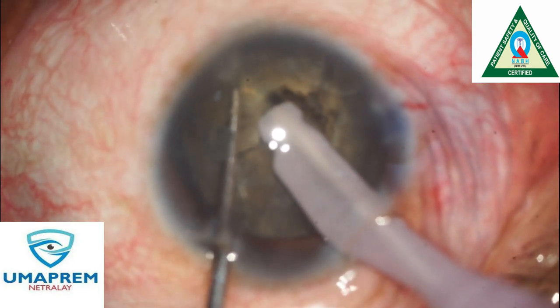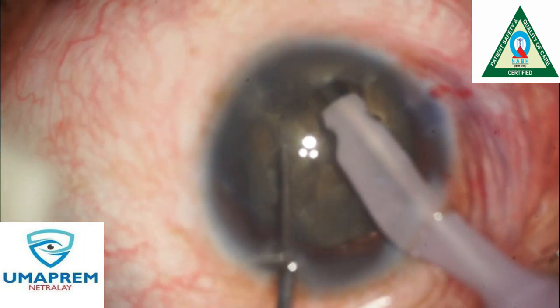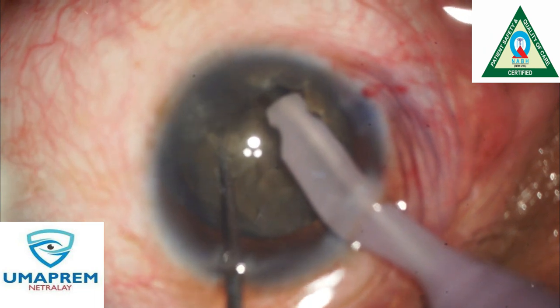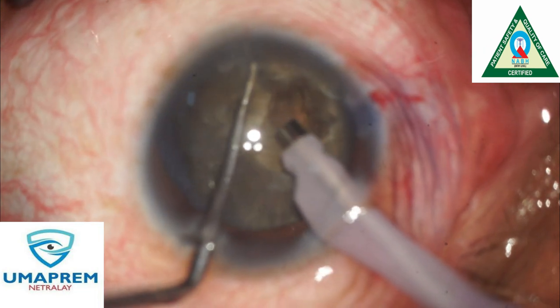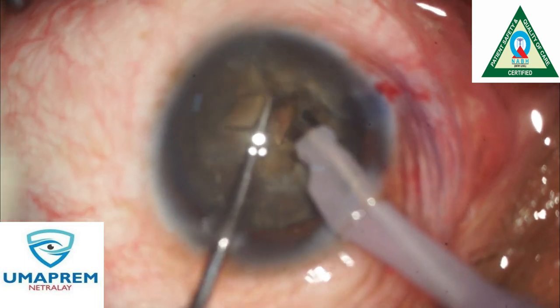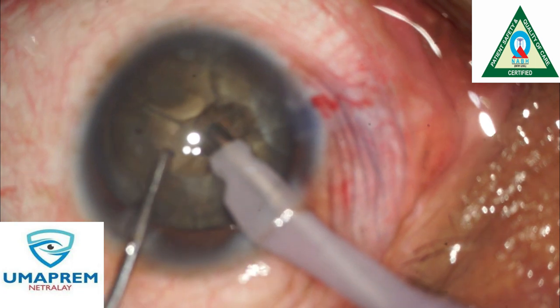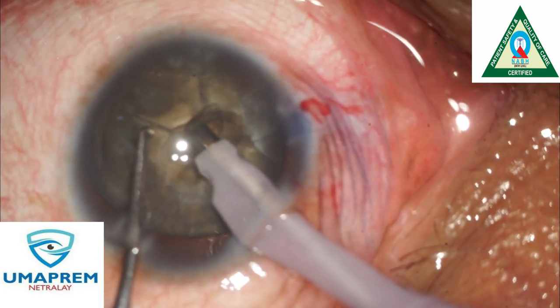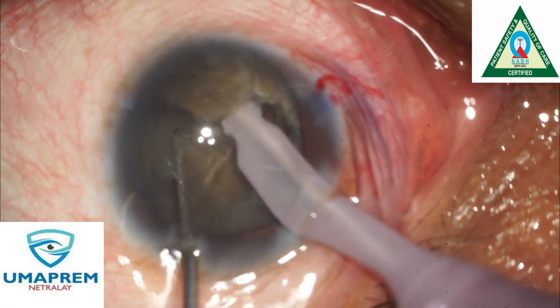See — this is a very hard nucleus, so we can make 6 to 7 pieces of the large nuclei. We make a chop, ensuring that the chop length is sufficient.